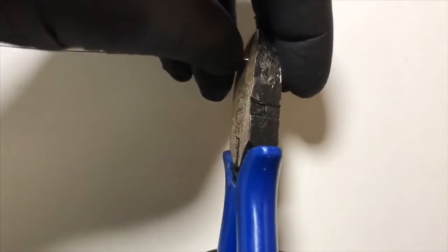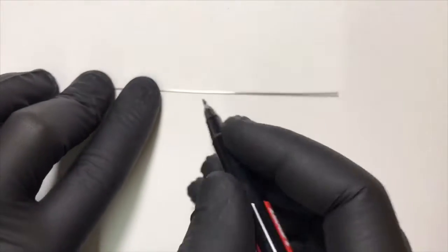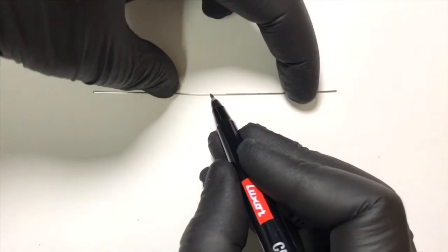We can now cut the slide bend of the wire that was engaged in the flat base of the universal plier, and now we have a straight wire. In the next step we mark a central point on the wire where our helix will begin.